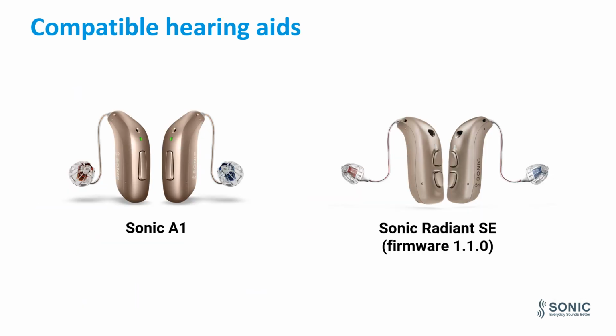It is compatible with Sonic A1 and Sonic Radiant SE hearing aids. For Radiant SE, make sure the firmware is at least 1.1.0. And for all other hearing aids, ACT will not influence or adjust the settings at all.